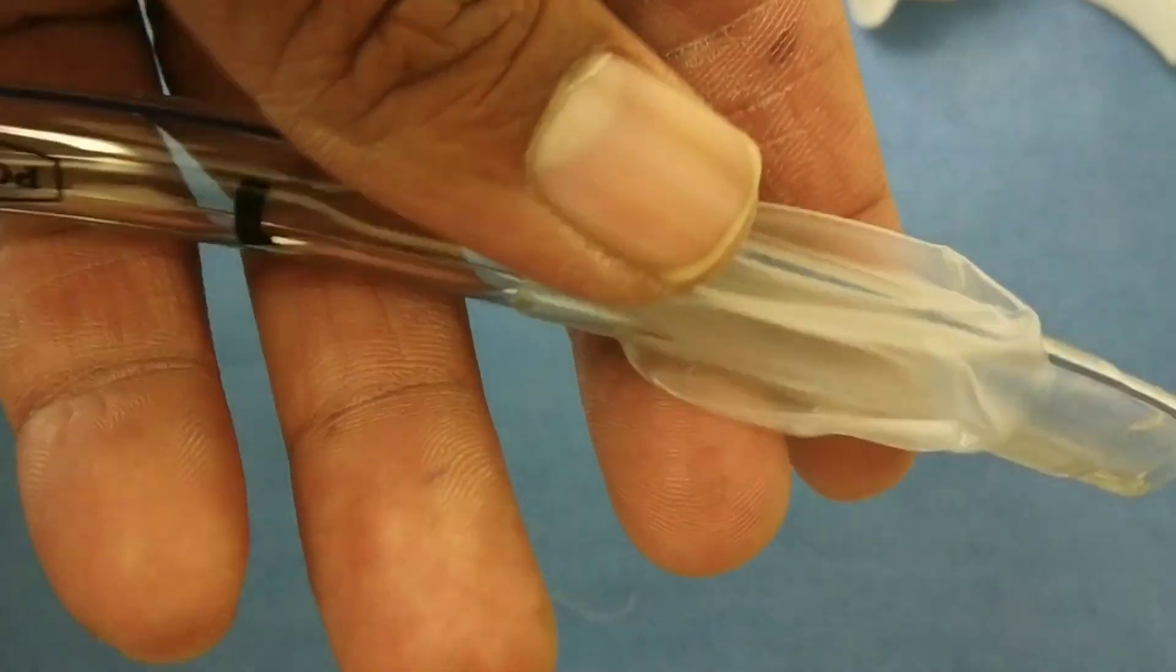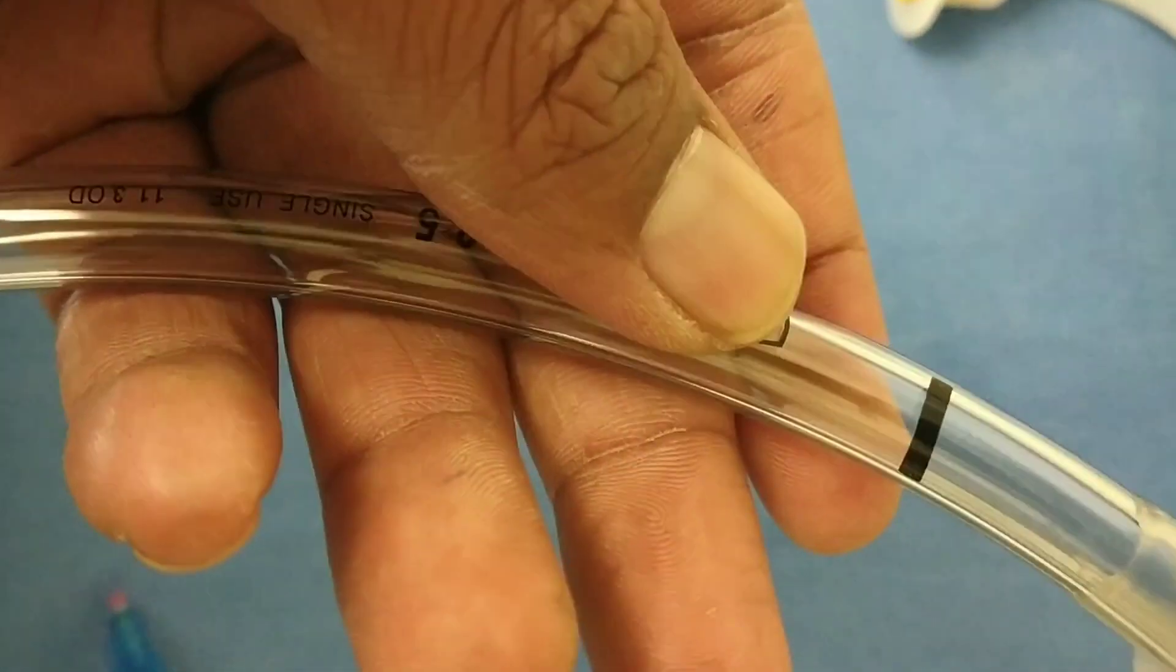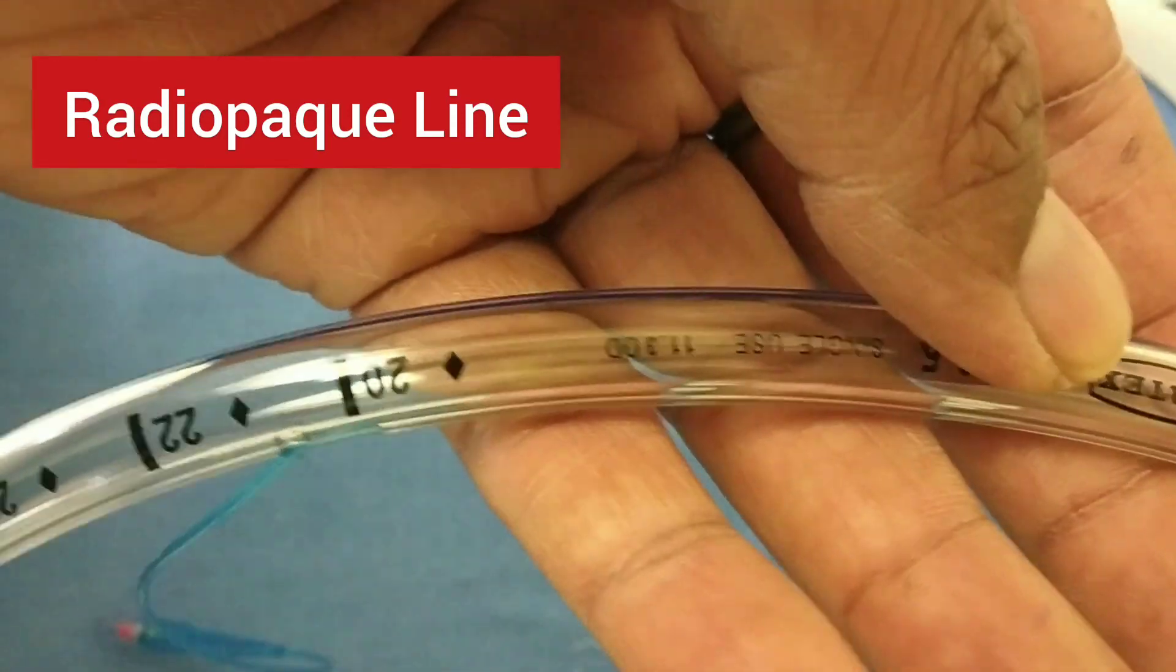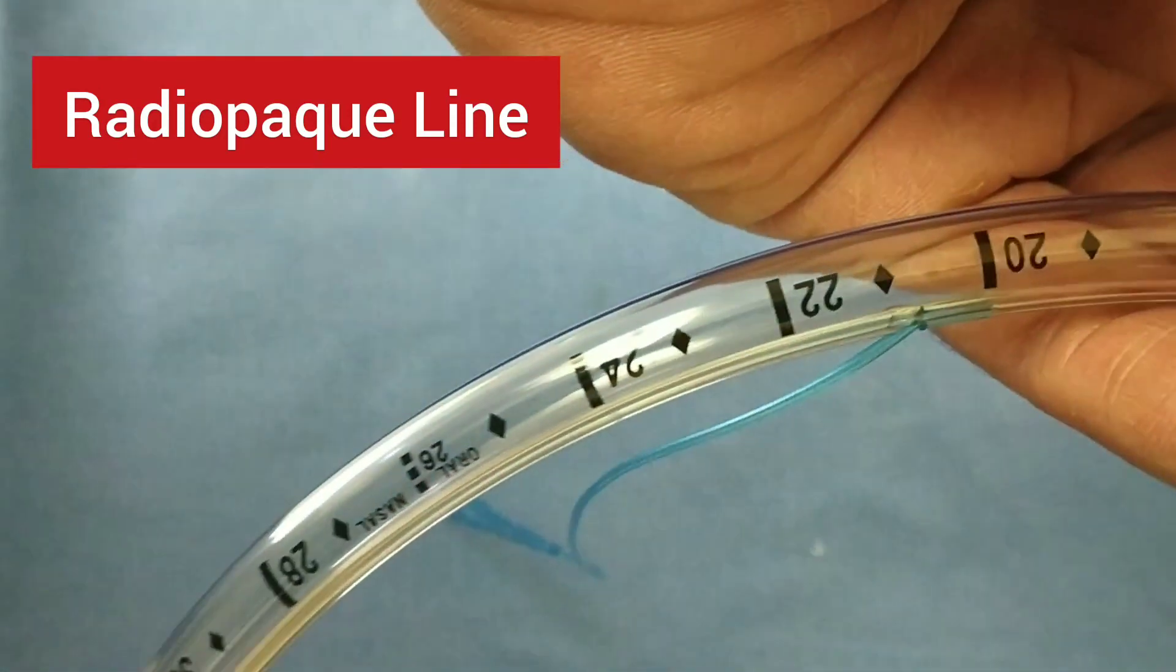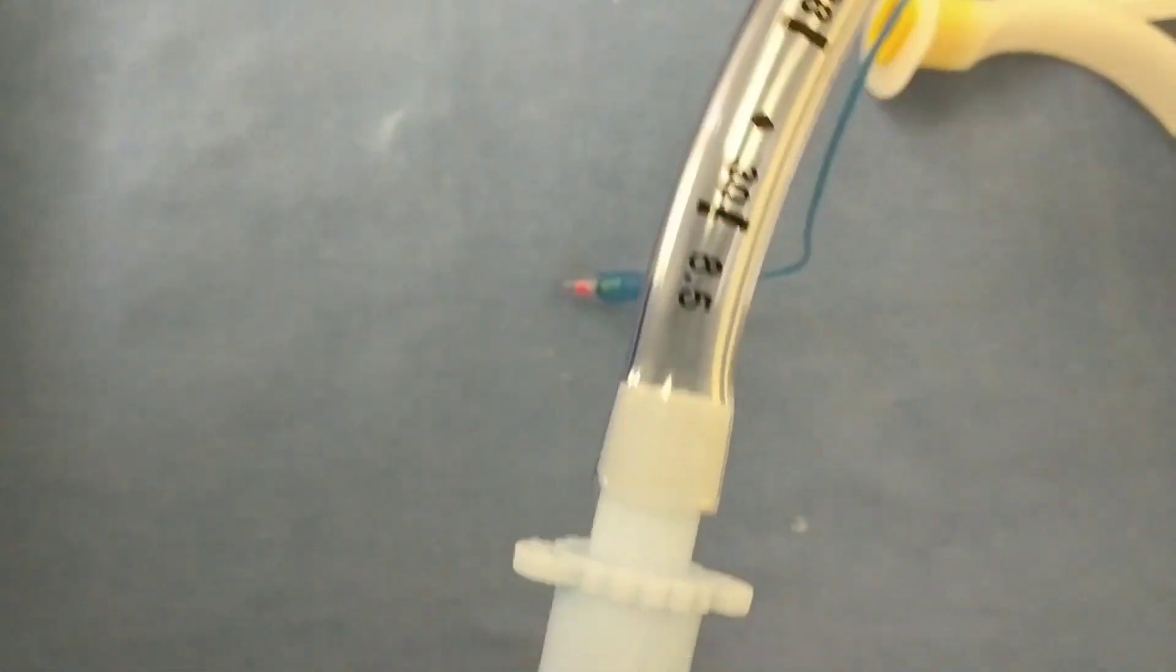In general practice in ICUs, after every intubation, one x-ray is taken to find out whether the ET tube has been fitted properly or not. The radio opaque line runs continuously from start to end of the ET tube. There are also values given for the internal diameter of the ET tube.